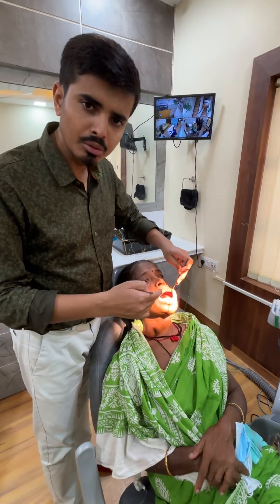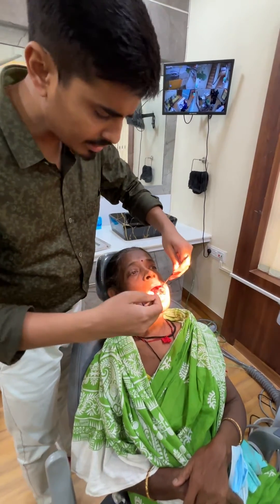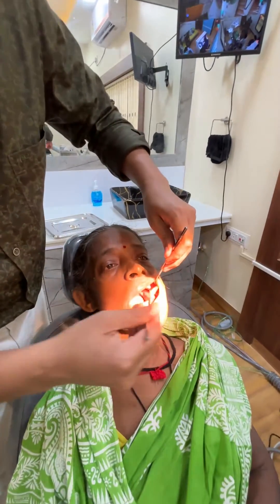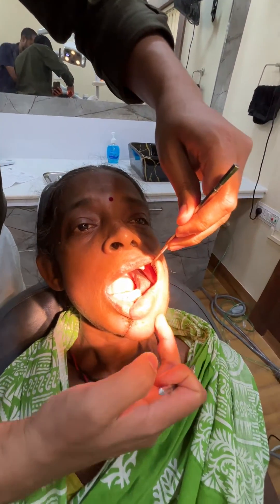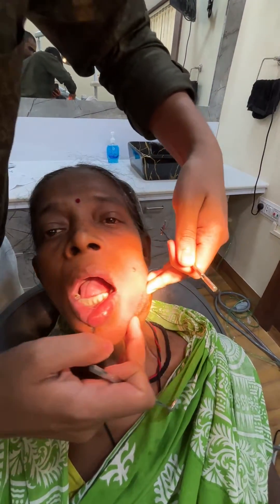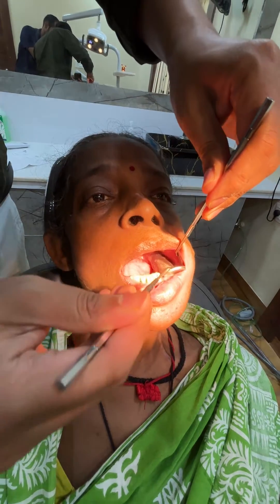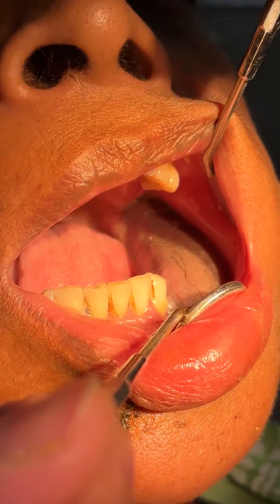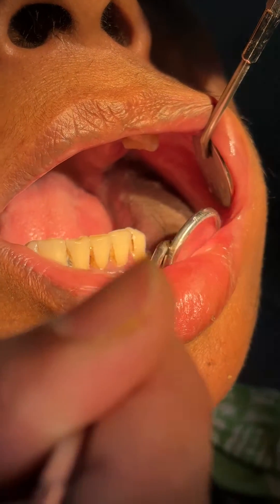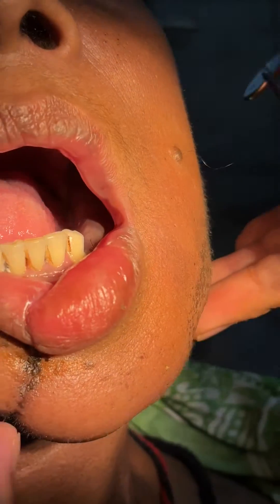This patient had an oral squamous cell carcinoma of the left gingival-buccal sulcus. We had to remove the hemimandible, from here to here, and a modified radical neck dissection (MRND) was performed. Interorally, you can see the skin paddle and the fibular bone — we used a free fibular flap to reconstruct the mandible.